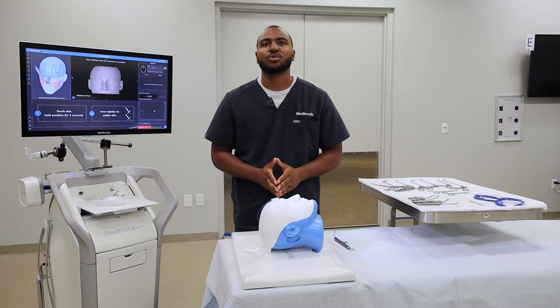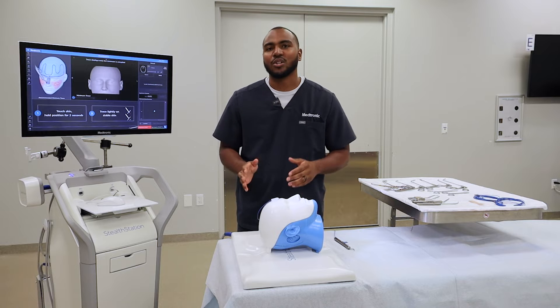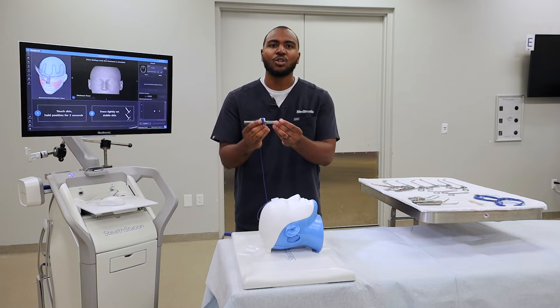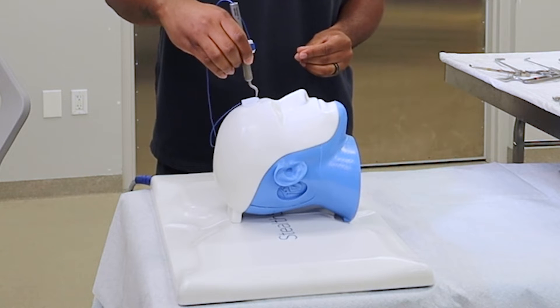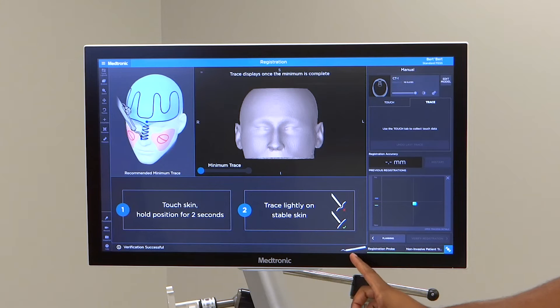You start by verifying the registration probe. You'll hear a quick chime when it's verified, and it will also appear on the bottom right-hand side of the screen. To verify the registration probe, you want to insert the tip into the divot of the patient tracker perpendicular. You'll hear that quick chime and it'll also pop up on the bottom of the screen saying 'registration probe.'